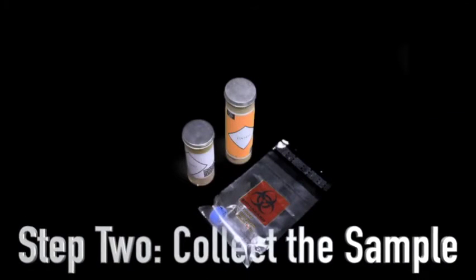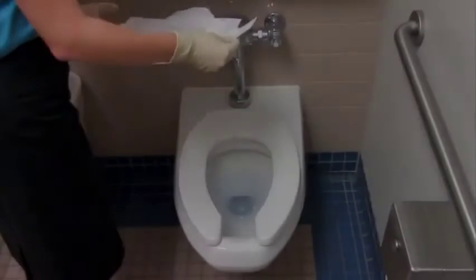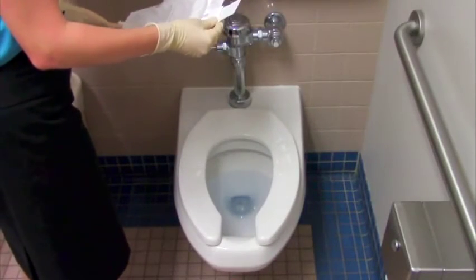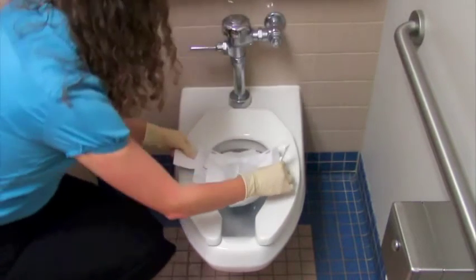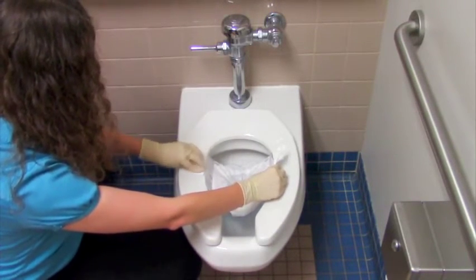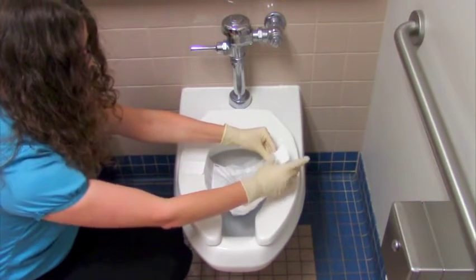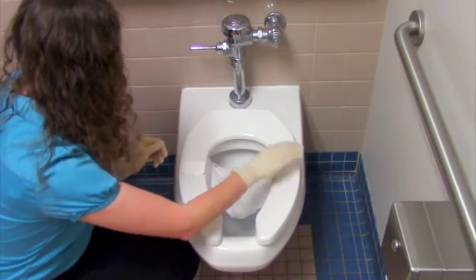Step 2: Collect the sample. Peeing on your stool sample can ruin the test, so be sure to pee before you begin. Lay the cardboard and tissue paper liner on a flat surface with the liner print facing up and fold the side flaps up. Peel the backing off the adhesive tape on both sides of the liner and attach to the top of the toilet seat towards the back of the toilet bowl with the liner print facing up.